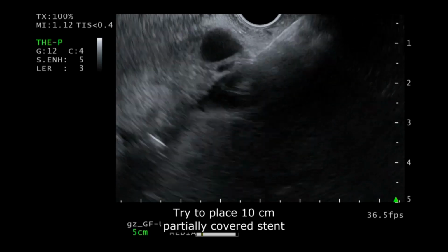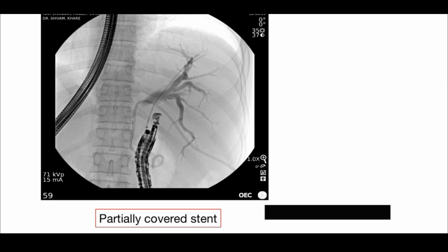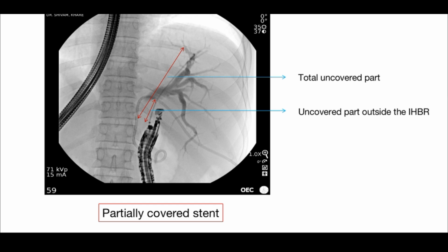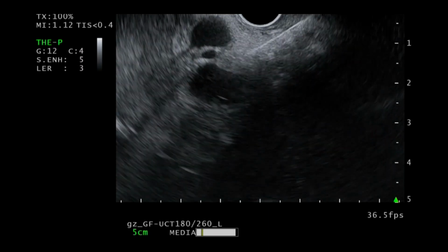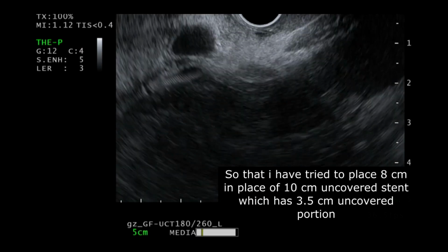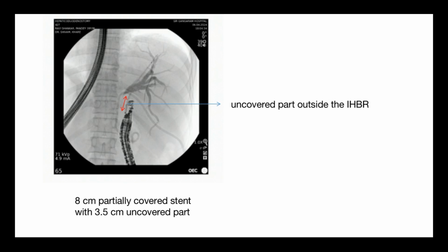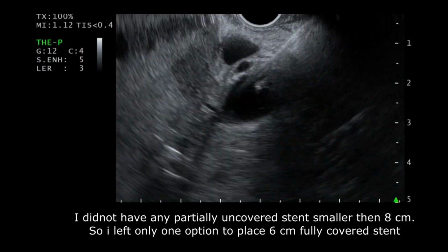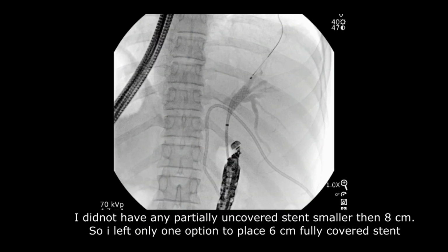Then I tried to place a 10 cm partially covered stent. This red arrow shows the total uncovered part of the stent, and the small red arrow shows the uncovered part outside the IHBR. So there were chances of bile leak if I put this stent. So I tried to place an 8 cm in place of the 10 cm stent, which has a 3.5 cm uncovered part. But still some uncovered part is outside the IHBR. I did not have any partially covered stent smaller than 8 cm, so I was left with only one option: to place a 6 cm fully covered stent.